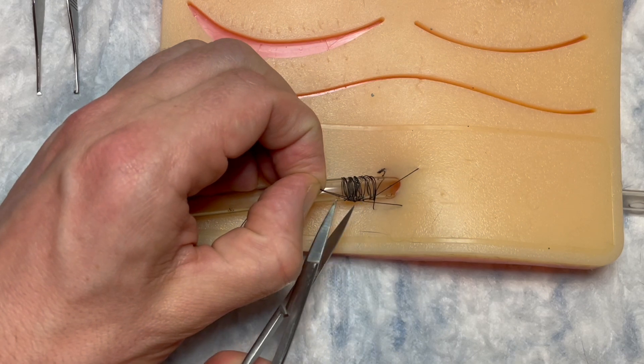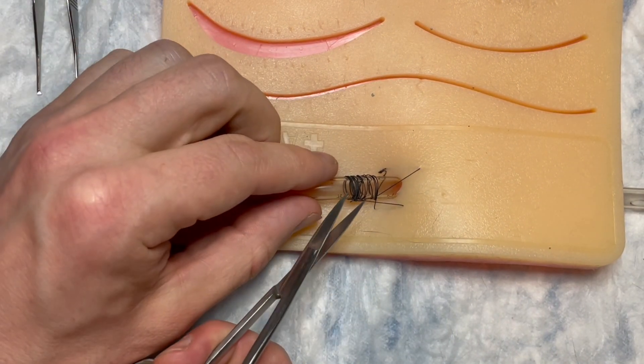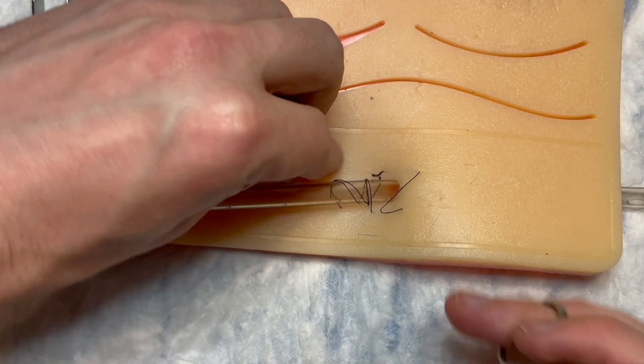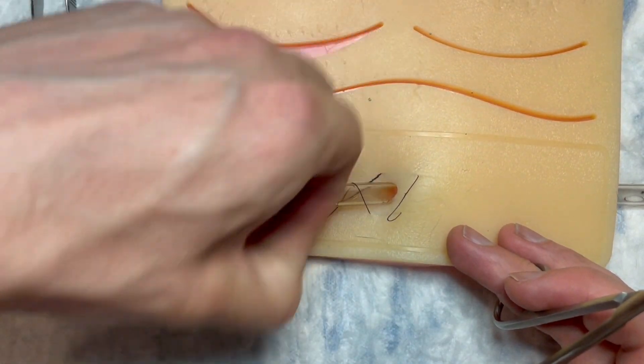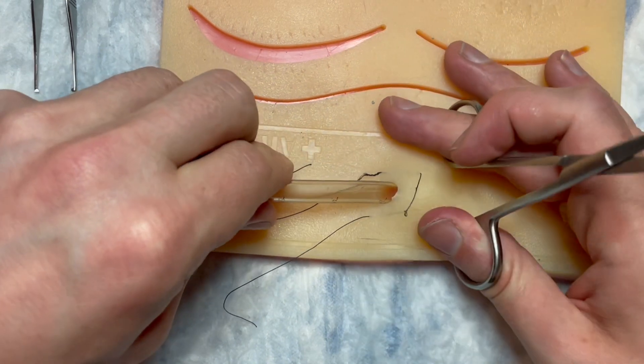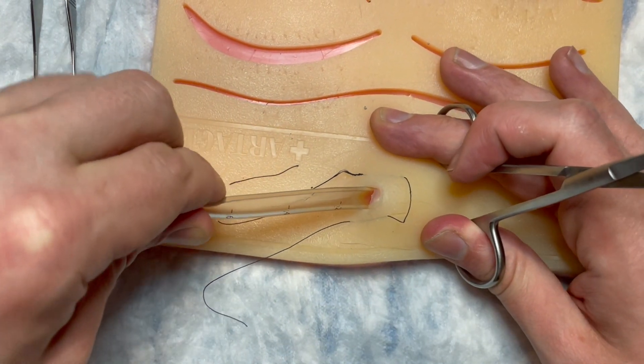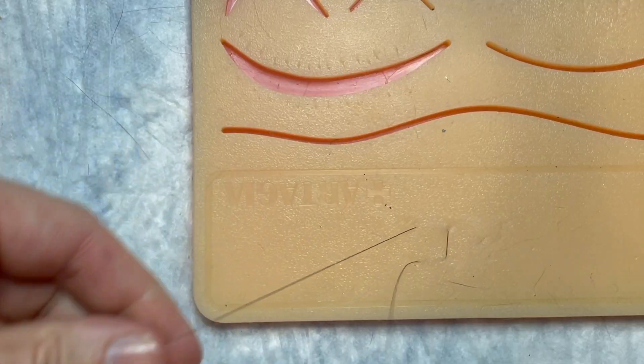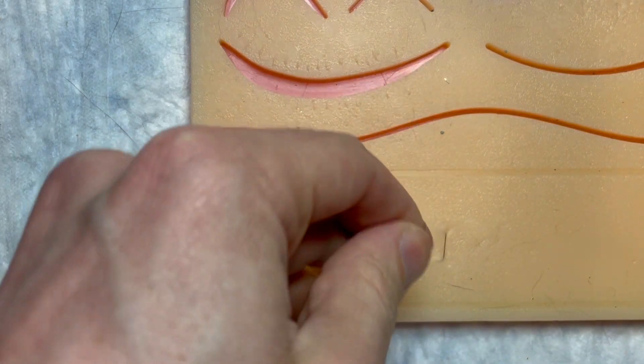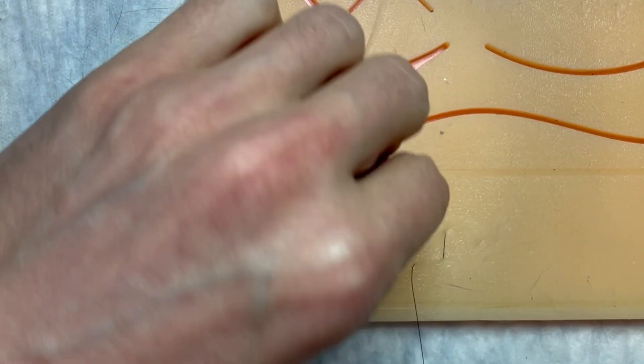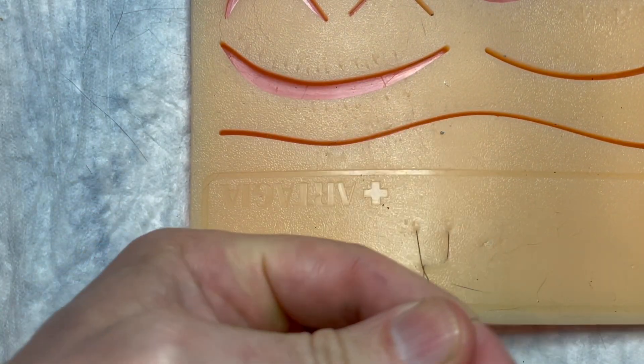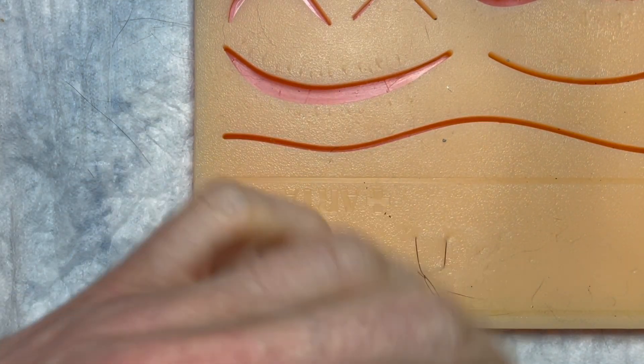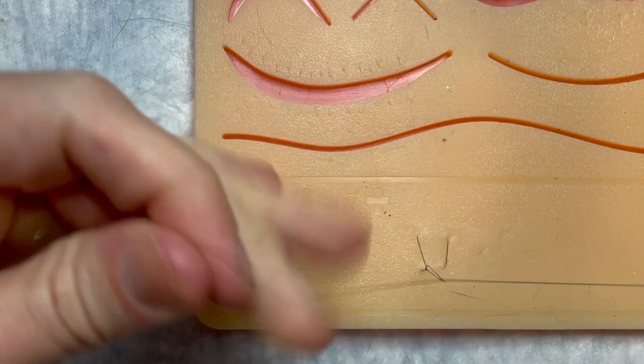If we needed to remove all this, we're removing all this, slide the chest tube out, and now here and you see what we're left with. Now you have a pretty decent sized cut here and all you can do at this point if you have enough string, and you can create a tie and just close off your chest tube and not have to suture anymore into the skin.